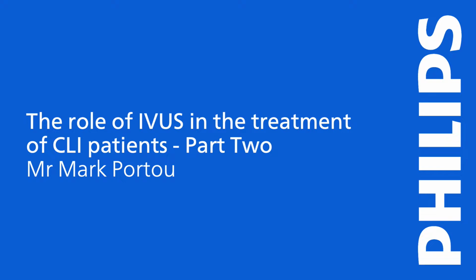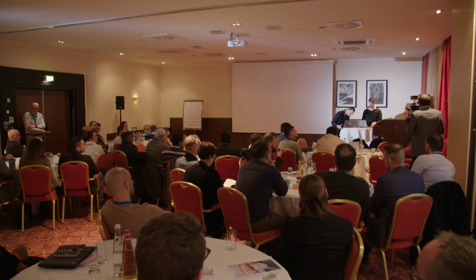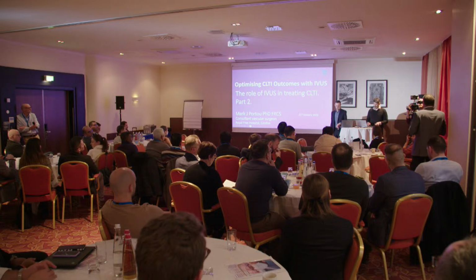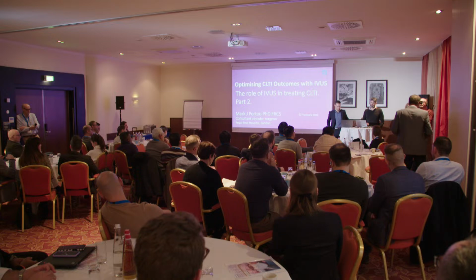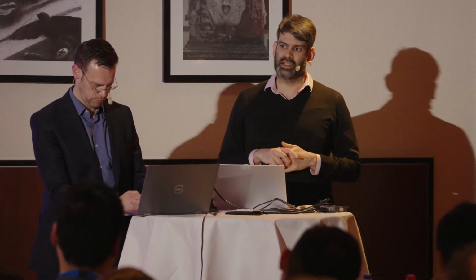So I've got one for you, NT. If you were to start using IVUS in your practice, what vessel bed would you aim to use it for as an early use beginner? I think that depends on where you're coming from. I used to just straight away say FemPop for this, but now, having seen the journey that so many people have had before they've started using IVUS in peripheral, if you're confident using it in venous disease, then it means that your idea of the steps and the workflow and handling the machine, you're probably already there.